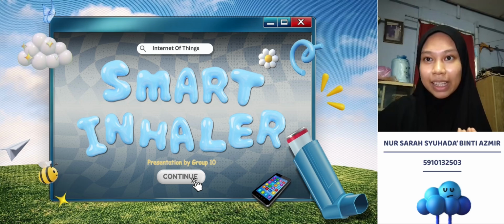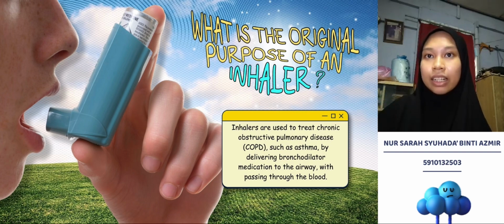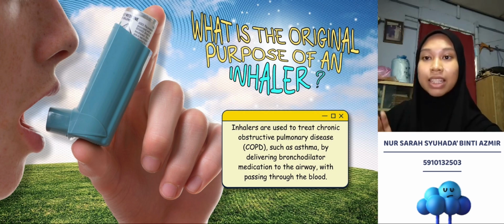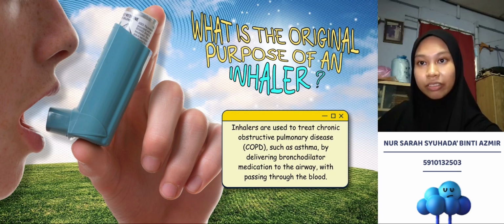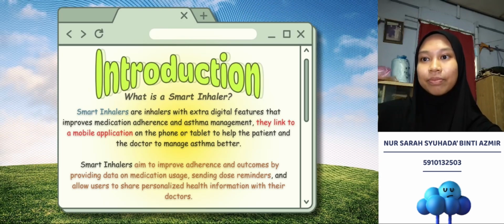We choose Smart Inhaler as one of the examples of IoT, or Internet of Things. So, what is the original purpose of an inhaler? Inhalers are used to treat chronic obstructive pulmonary disease, or COPD, such as asthma, by delivering bronchodilator medication to the airway.